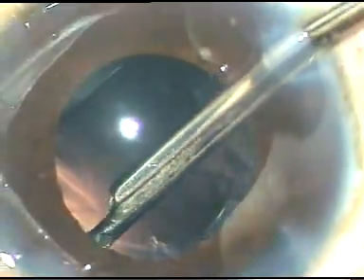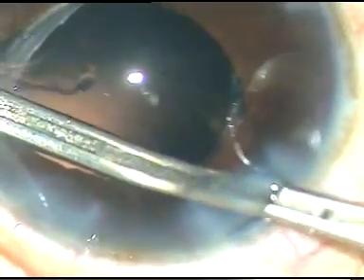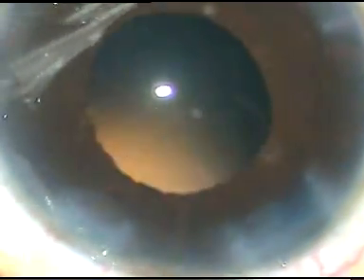Now, cortical cleanup is done. At this time, the pupil size has become a little smaller. You cannot see the rhexis margin on the left side. The pupil size is about 5 millimeters or a little less than 5 millimeters at this moment. Now, cortical cleanup is done. I have to check like this — just push the iris with the Simcoe, and you can check whether any cortical lens matter is remaining anywhere.